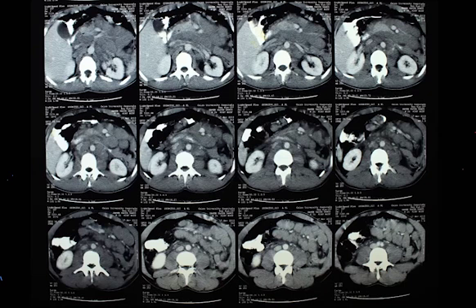You just go describing. For God's sake, you just describe. You cannot ask yourself, you cannot request that you know the diagnosis. You have not seen enough CTs to know the diagnosis of everything. You should not be exhausting yourself like that. You should be able to describe, because this you've known to describe. You can describe anything.